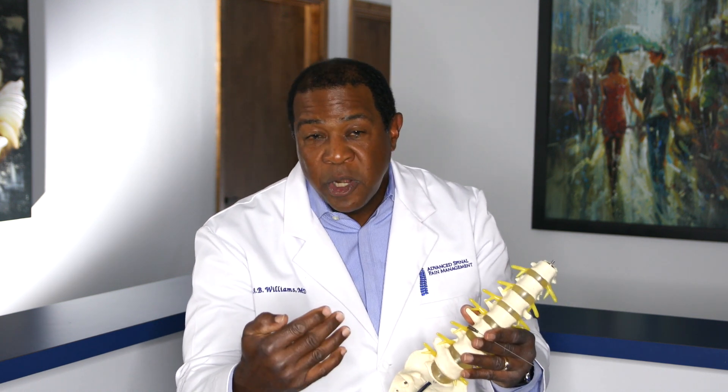That needle is placed very carefully using guidance of fluoroscopy — some people use CAT scan, but I use fluoroscopy because I can get a real-time picture — using imaging of the spine to carefully and safely place the needle into the vertebral disc. Then we study the disc to determine if it's the source of your pain, whether it's back pain or leg pain.